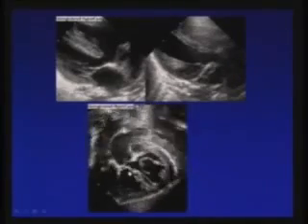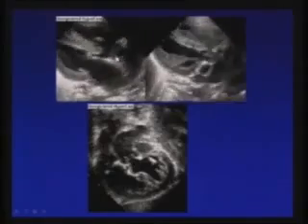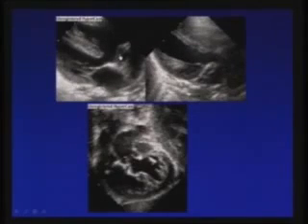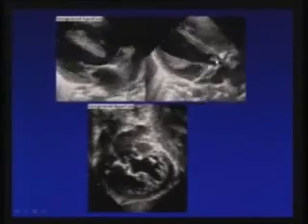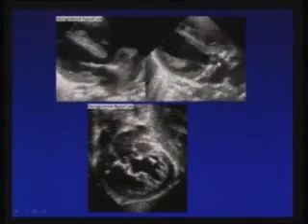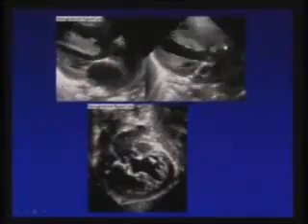Here you are seeing the ventricular septal defect, with the tricuspid valve coming in the way of the VSD. So, parallel great vessels. And this is in the parasternal long axis view. This is the ventricular septal defect, and the pulmonary artery overrides the defect. While with normally related great vessels, the aorta is the structure which overrides the defect. So VSD, pulmonary artery, which is turning posteriorly. Normally the aorta goes in this plane, just straight, while with TGA the pulmonary artery tilts posteriorly, and this is the aortic valve which is anterior and just descends downward.